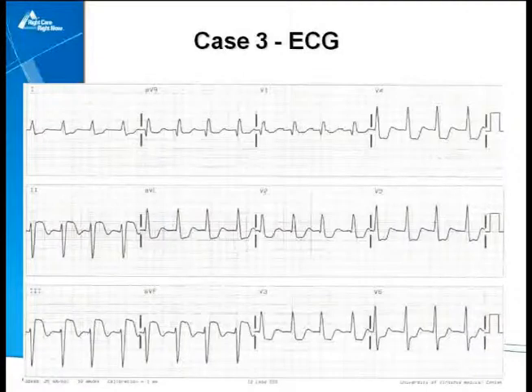First of all, remember what I said. Let's go back to the question. Mitral valve disease, status post-MVR, on no other medication. So this is somebody who has atrial disease, right? So we're going to think about atrial arrhythmias. Then what type of arrhythmias do people with mitral valve disease get? They get atrial fibrillation, they get atrial flutter. They can also get very slow forms of atrial flutter, which fall in the range of atrial tachycardia.